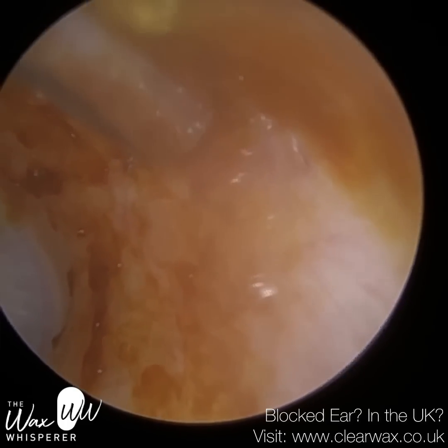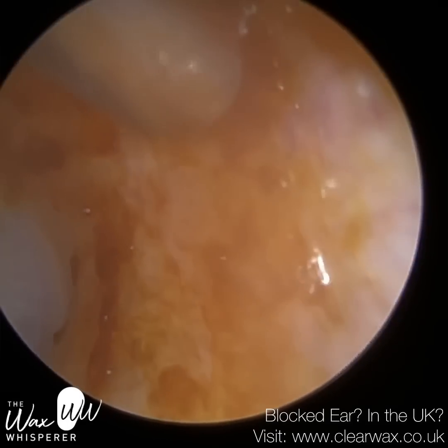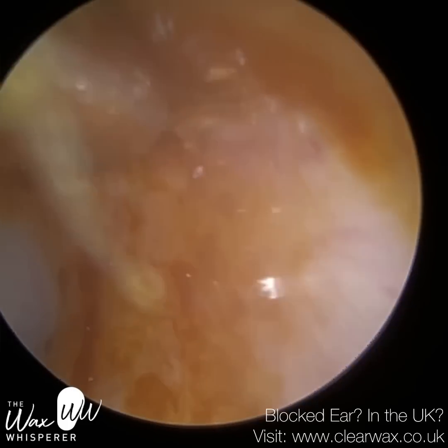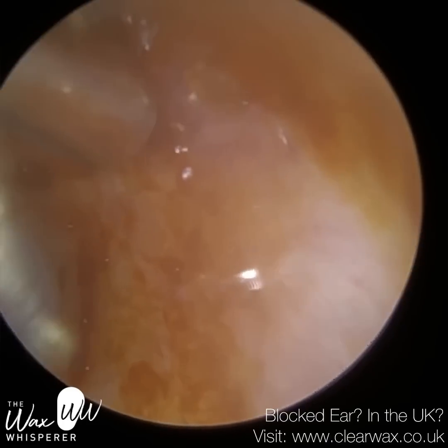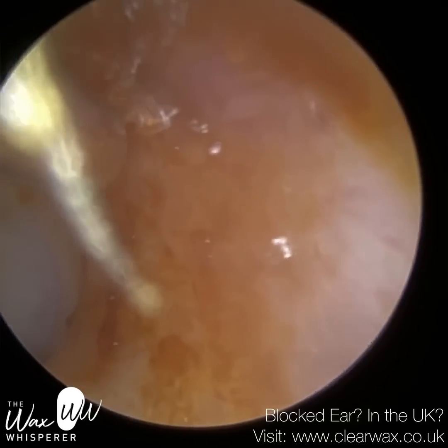And conversely, you can get someone with a huge amount of earwax and you can't see anything, it's completely blocked the ear canal, but the patient doesn't notice any symptoms. So with the grading system, I haven't done it based on symptoms because it's impossible to do that. So I've done it on how much it occludes the view. So there's 5 grades, but the first one I've named a grade 0. So grade 0 is when you've got natural surface coating wax, so it's non-occluding.